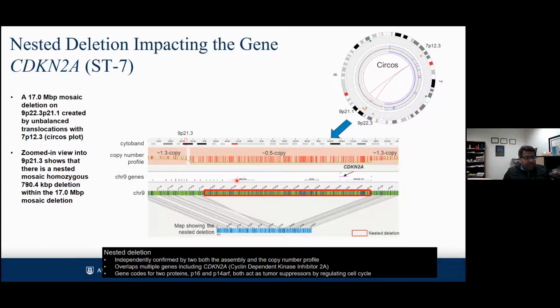The unbalanced translocation is beyond the detection of SNP microarray, because that's a major limitation. And as I said, not only are we able to get 100% concordance with the SNP microarrays, but on top of that, we are identifying potentially clinically relevant information which was not identified earlier, even in the TCGA database, because most, if not all, of the TCGA database is done on Oncoscan.